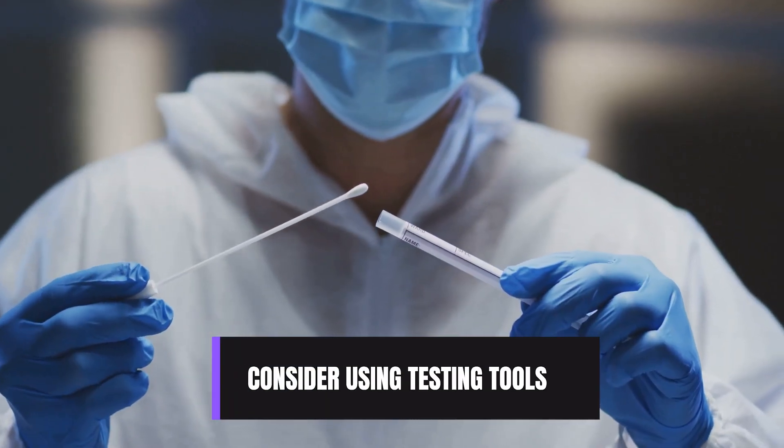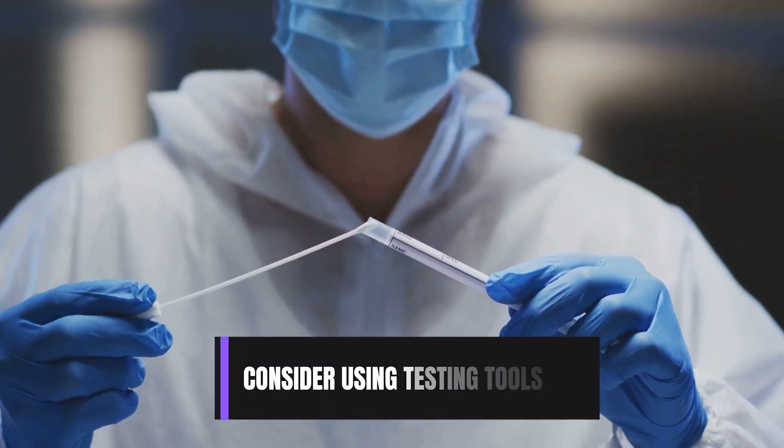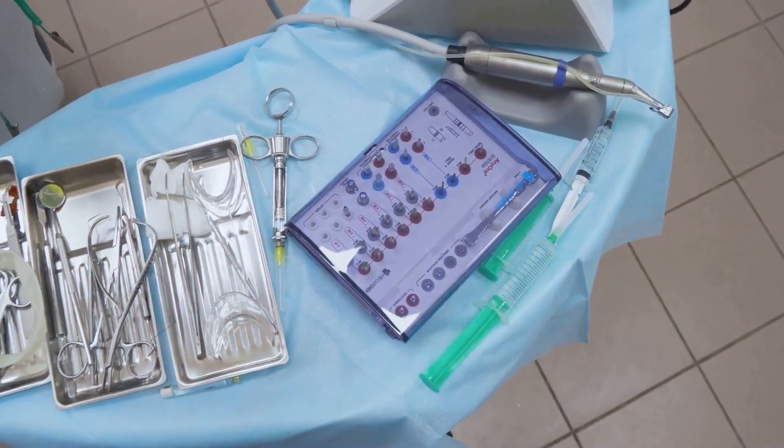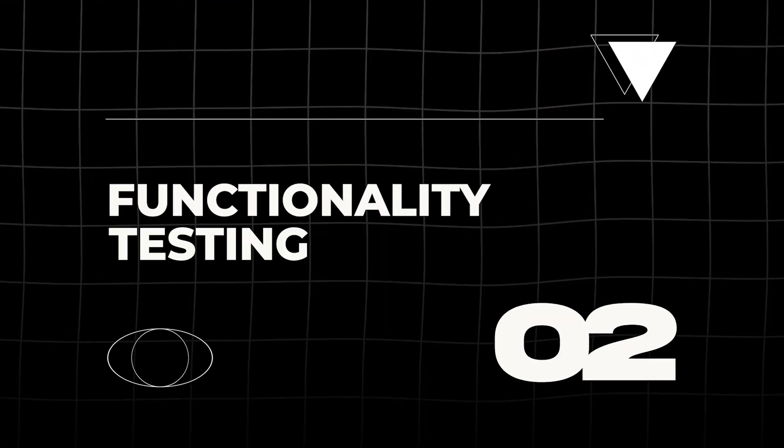Consider using testing tools like protein detection swabs for a more precise check of the cleaning processes. If you find contamination, the instrument should be returned to the decontamination room for re-cleaning immediately. You will also need to clean the workspace that you are using.